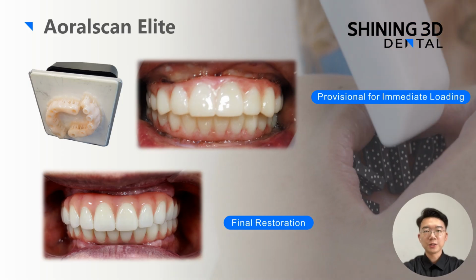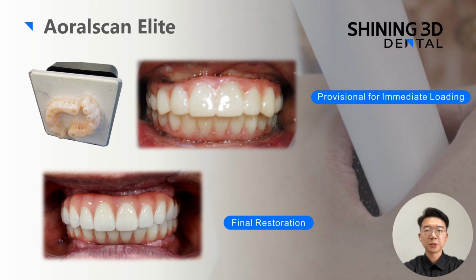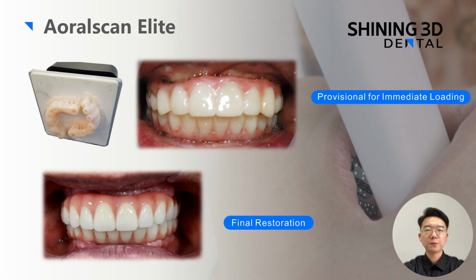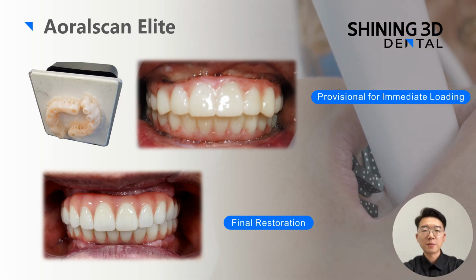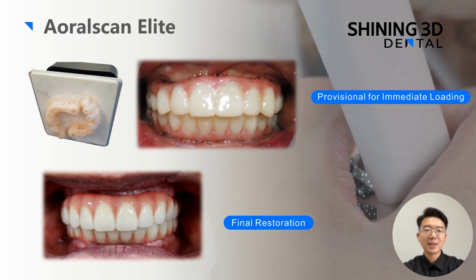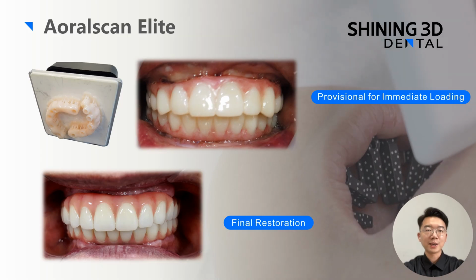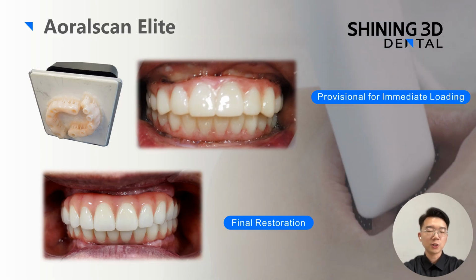Aoralscan Elite uses intraoral photogrammetry technology to quickly and accurately capture implant positions for full arch implant restoration cases. With 5 micrometer precision, it can capture accurate implant position data for both immediate loading cases and final restoration cases.